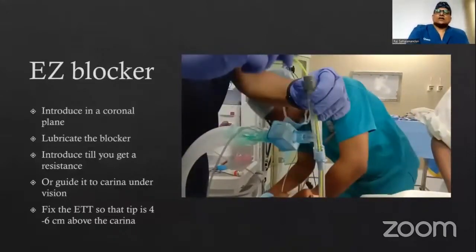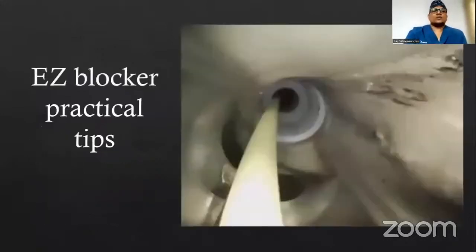Whenever you use all these tubes, make sure that you don't put it too much in. The tube should be 4 to 6 centimeter above the carina. So for a normal Indian patient, about 19 or maximum 20 for a female, and 21 for a male, that's good enough. Then the tube will be sufficiently away from the carina. The reason I'll tell you.